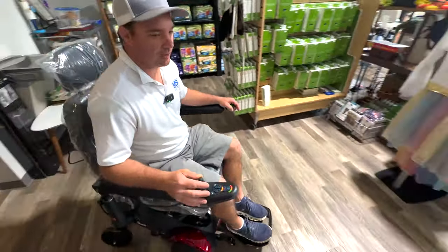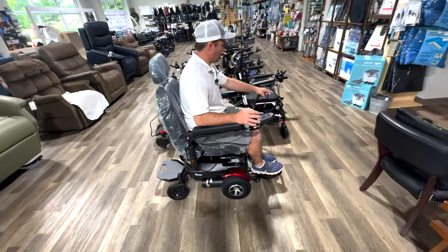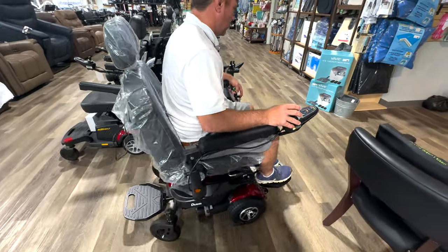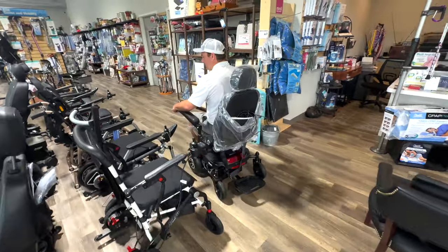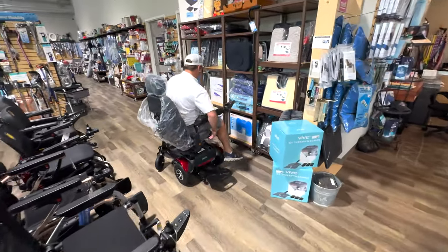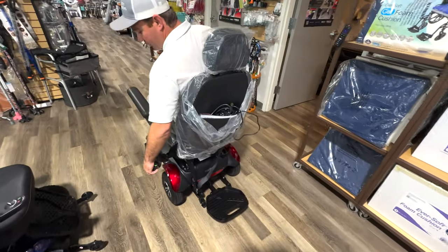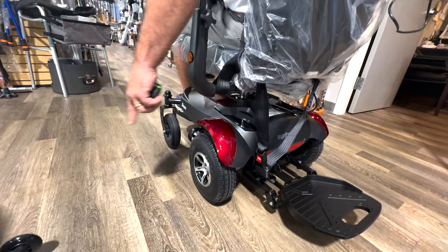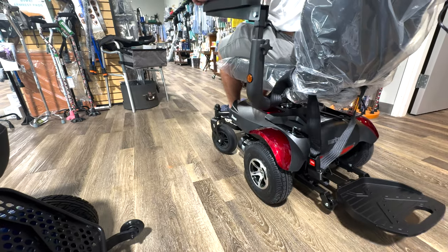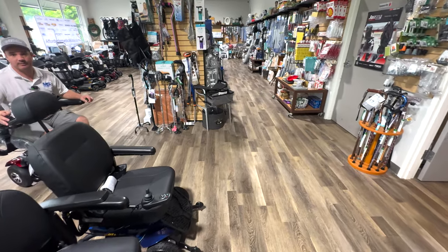Let me explain the turning difference. With front wheel drive, you come to the doorway and start making your turn right away. With back wheel drive, you approach the door from the side to get your back wheels to the door opening, and then make your turn in. That's how you learn to drive one of these with back wheel drive.